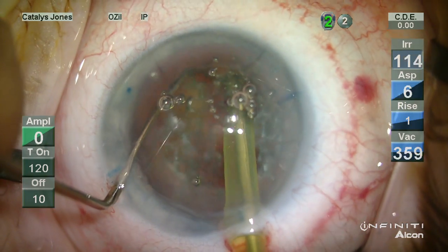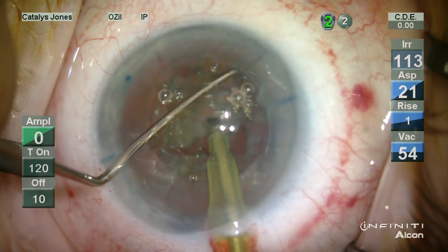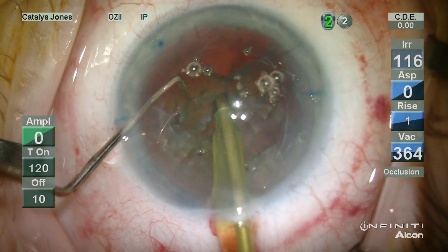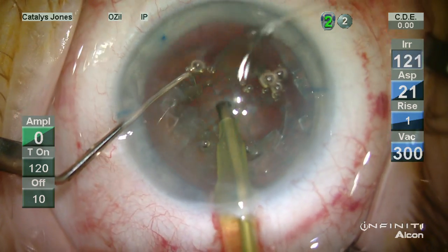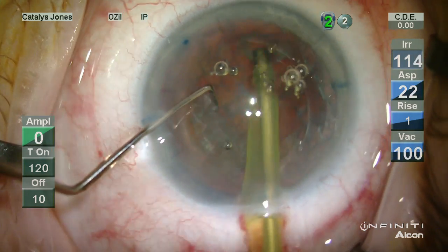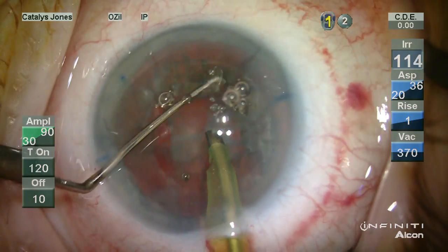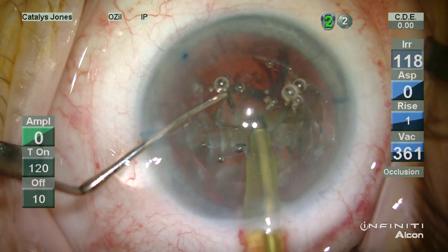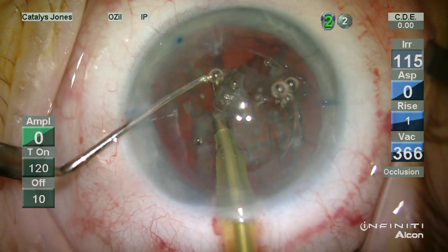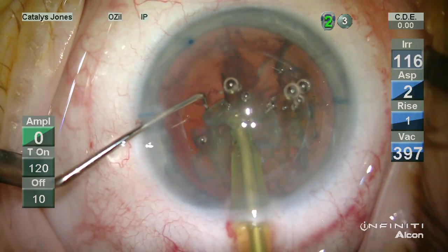The phaco tip here is an MST Dewey radius tip, 700 microns in internal diameter without an ABS port. This is a Kelman style tip, and given the Dewey radius treatment to the bevel, this permits a greater level of safety in approaching more peripheral material within the capsular bag, and also permits a more efficient evacuation of this softened nuclear material.